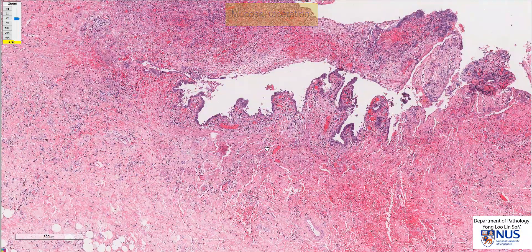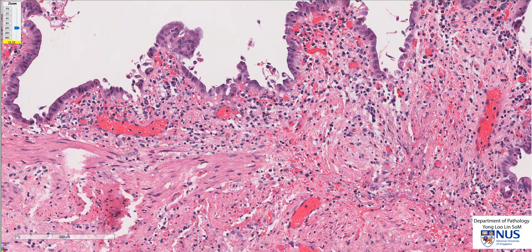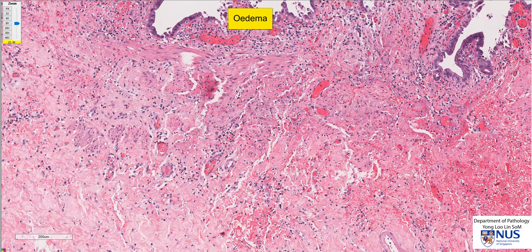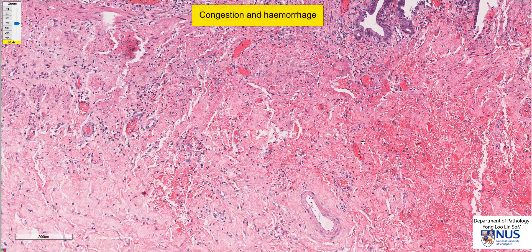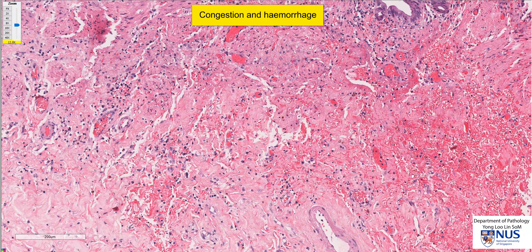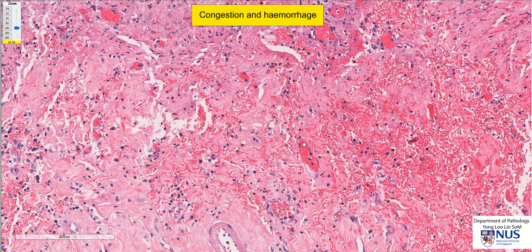If we look at the lamina propria, we can see that it is expanded, and the reason it is broader and more expanded is because there is edema within the mucosa. You can also see that there are some paler spaces in between the cells in the muscle layer as well as in the subserosa. So there is edema within the mucosa and the wall of the gallbladder. In addition, some of the vessels in the wall appear quite congested and are packed with red blood cells.